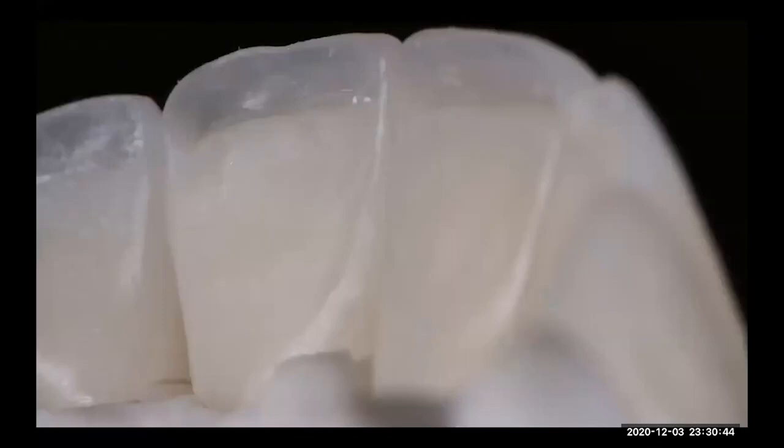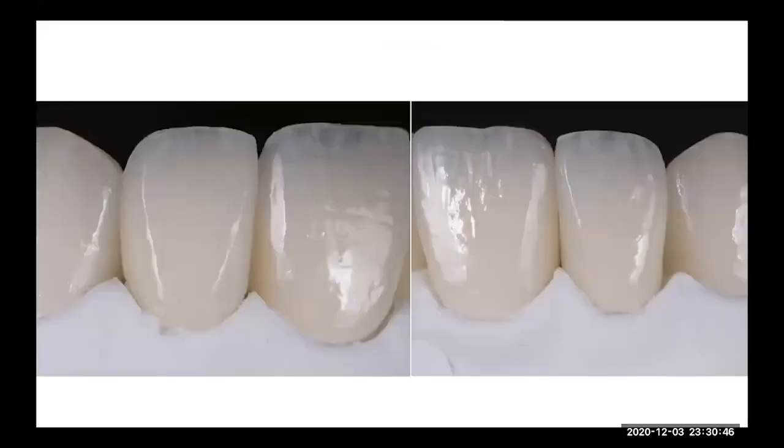You see, filling the concavity. You can see the translucency that we can create from palatal. It's really important that you work with a nice wax, because some waxes are more crystallized than others. I found out that the Geo one is really soft, really nice. So we can take the carver and go from the palatal side, and you can leave a nice surface.